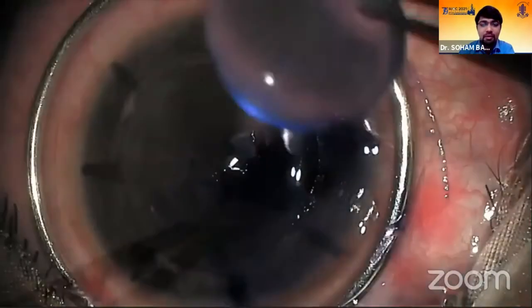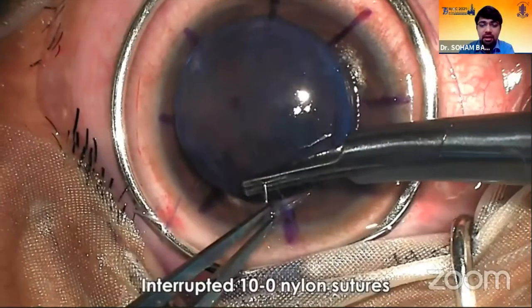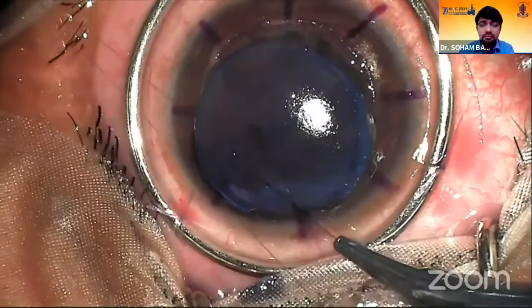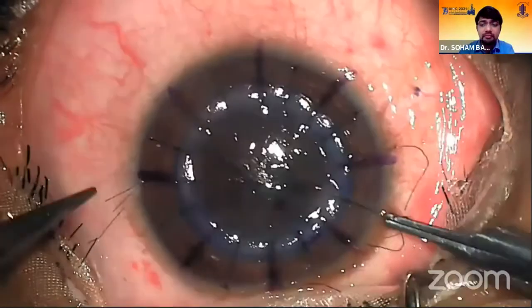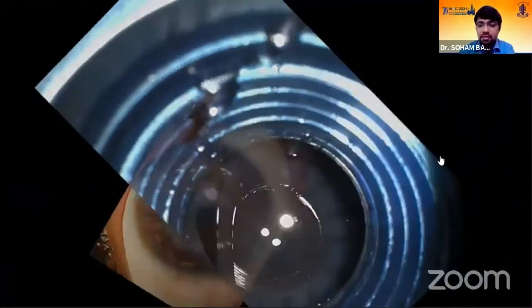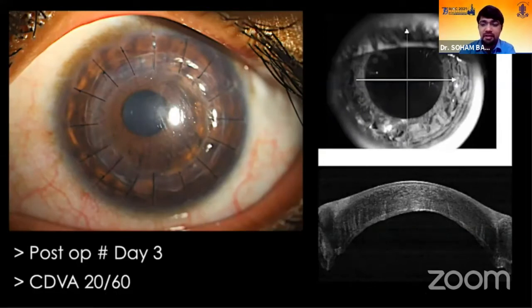This is quite similar to how you would do a DMEK graft preparation. And then for suturing, I prefer an interrupted technique with 10-0 nylon sutures. And then that's the end of the surgery. You can check with the keratoscope to see if there are any astigmatism adjustments to be done. So this is at day three. You can see the residual stroma is almost as thick as the epithelium. So you know it will be somewhere around 50 microns to 70, 80 microns.